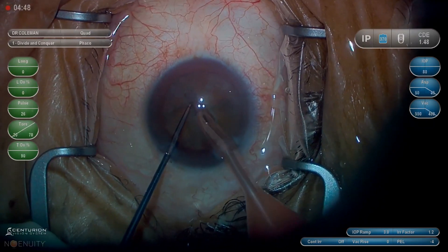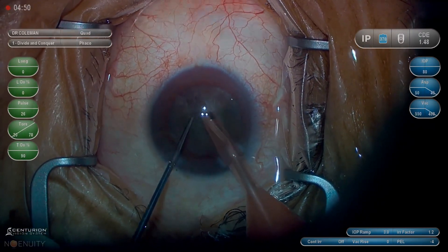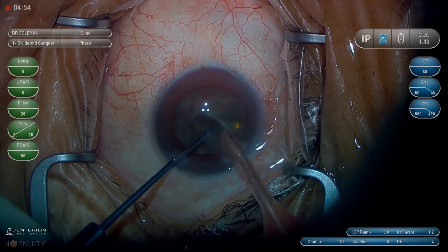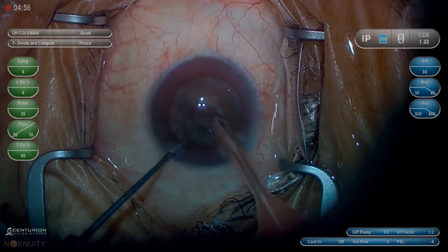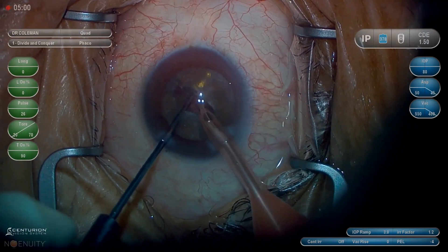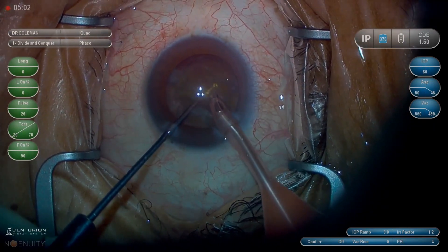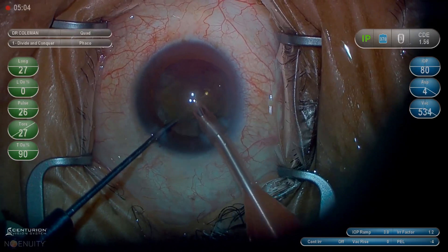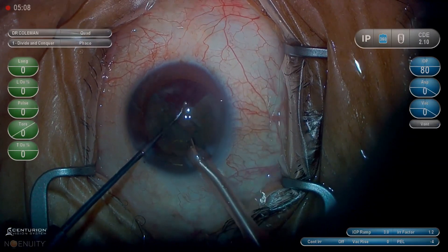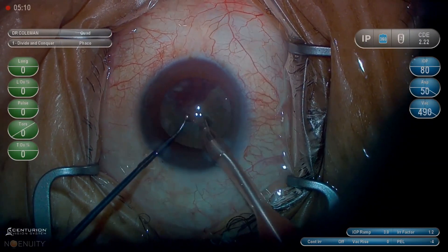We've just grooved three times. The Connor goes deep. The phaco is pretty deep, but not quite as deep as the Connor — we don't want to puncture the bag. Now we're going proximal to the wound, reaching far equatorial to get a mechanical advantage with the Connor. The Connor lifts up, reaches out and scoops. We don't want to get in a big hurry to crack a quarter off at this point, because we might accidentally crack off like a sixth or an eighth.